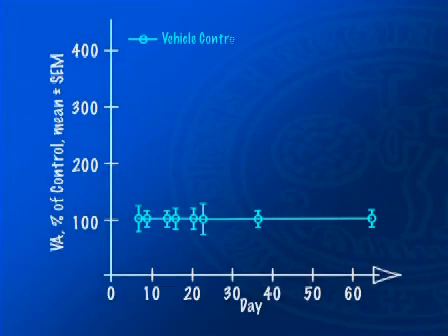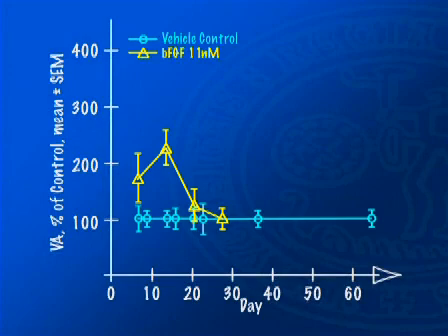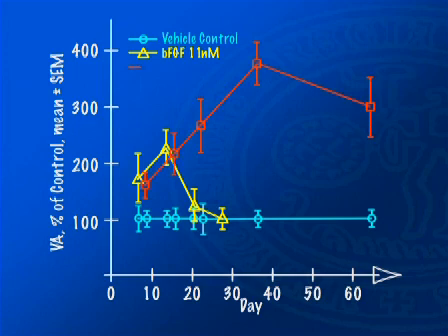Compared with angiogenesis mediated by VEGF or basic FGF at approximately physiologic doses, mast cell-mediated angiogenesis, MCMA, induced via selective activation of mast cells in situ, features considerably higher potency and remarkably longer duration. Actually, mast cell-mediated angiogenesis was first described using this assay.